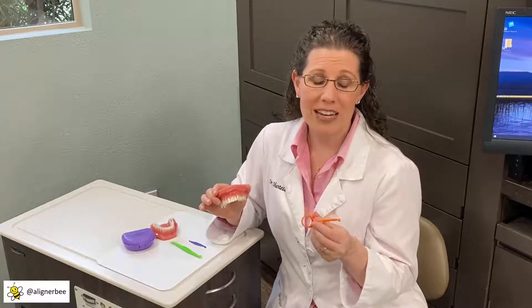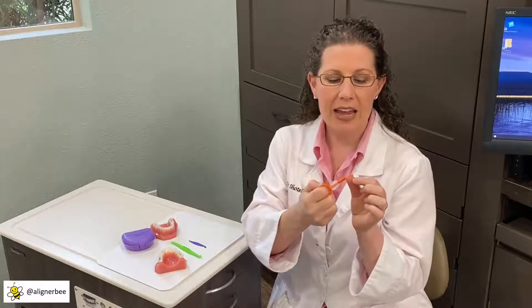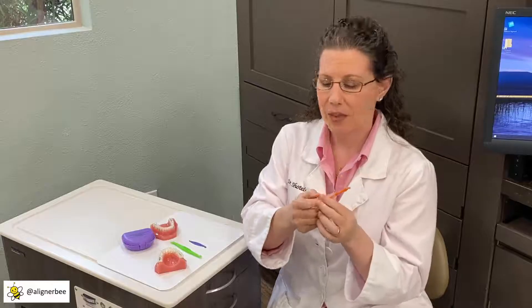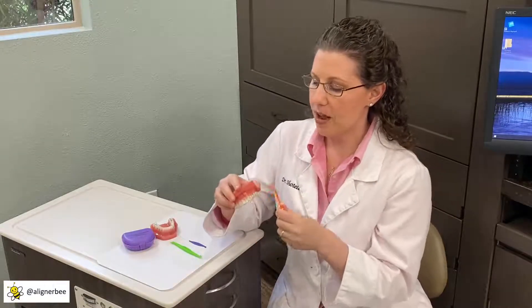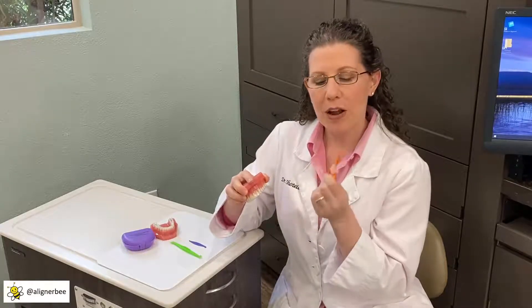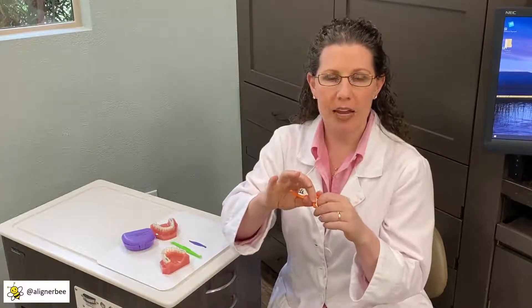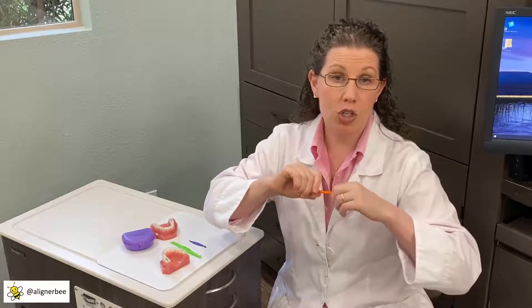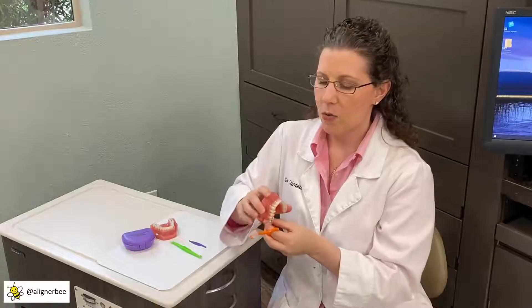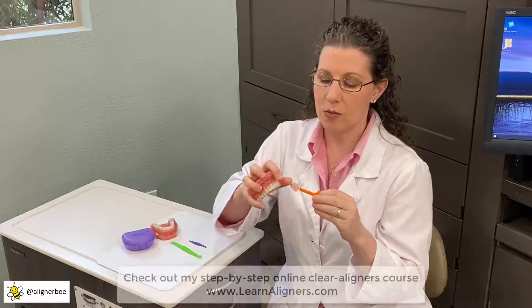One of the newer tools on the market that I found is very unique is the pull tool. The pull tool has a little handle to help the patient hold and has a little hook at the opposite end. It is designed to go up and under the edge of the aligner and to pull down at the inner proximal space. What I find really unique about the pull tool is that it has a little built-in chewy as well, so if patients want to use a chewy to help place the aligner back in, they'll place the aligner back in their teeth and can slide the silicone or rubbery end down and use it as a chewy.